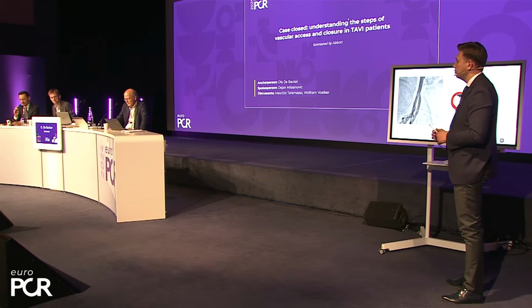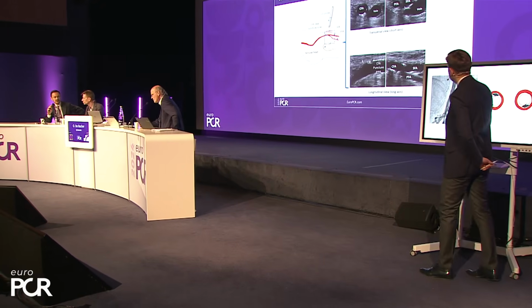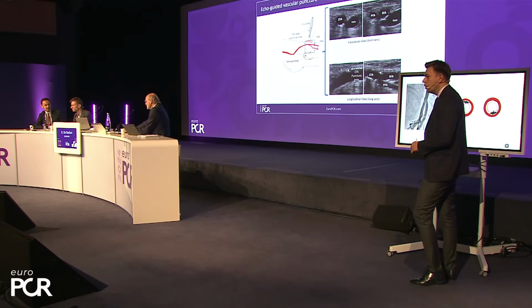Well, I totally agree with Ole. I think now it is almost mandatory to use it. We don't need any specific material. Everyone has an echo ultrasound machine in the lab, so we don't need any special tool. Many people think that it's not easy to puncture, but you gain so much information in such a limited amount of time with such a short learning curve that after 2-3 times, you are already fit in doing it. So I really don't see any reason not to use it, comparing what you have to invest and what you get back from the information.